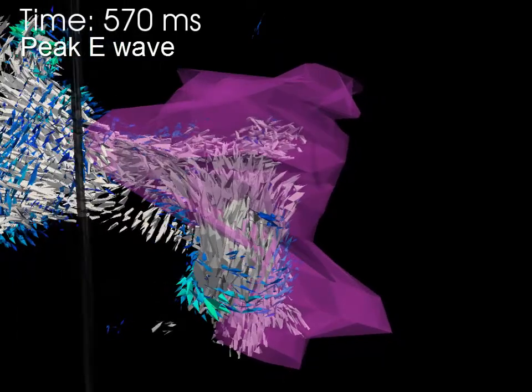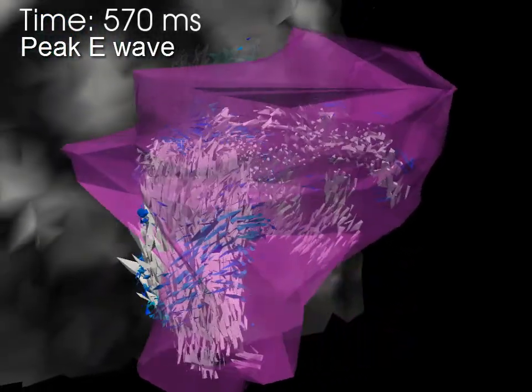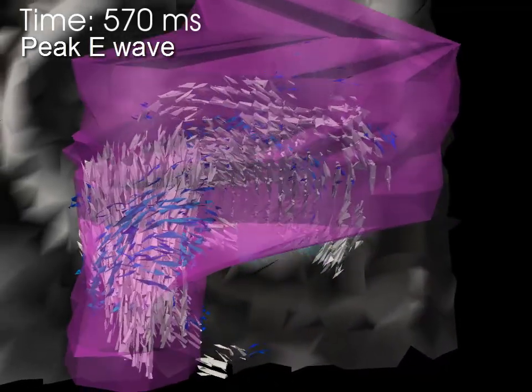Note the flow corkscrewing into the ventricle, although there is very little vorticity in the center of this flow.